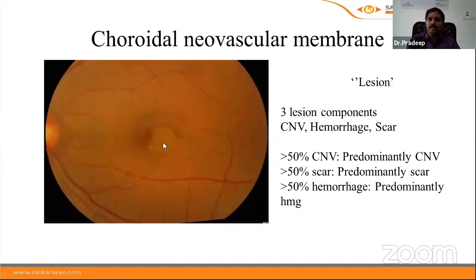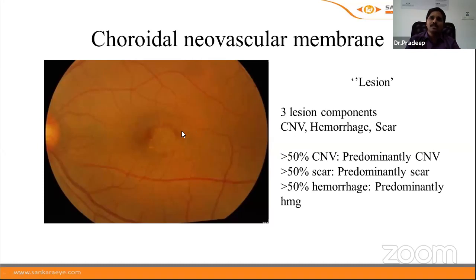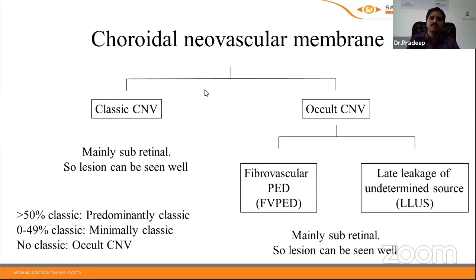Choroidal neovascular membrane lesions have three components: the CNV membrane itself, hemorrhage, and scar. If more than 50% of the lesion is CNV, it is predominantly CNV; if scar predominates it is predominantly scar; if hemorrhage predominates it is predominantly hemorrhagic. CNV is classified as classic or occult based on FFA. Classic CNV is located in the subretinal space and is well visualized on angiography. Occult CNV is located mainly in the sub-RPE space and is not well seen. Occult CNV is further classified as fibrovascular PED and late leakage of undetermined source.